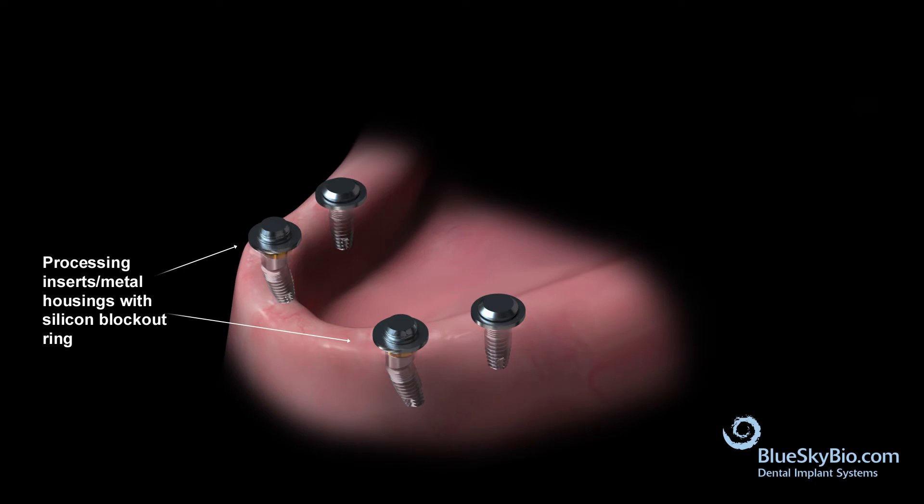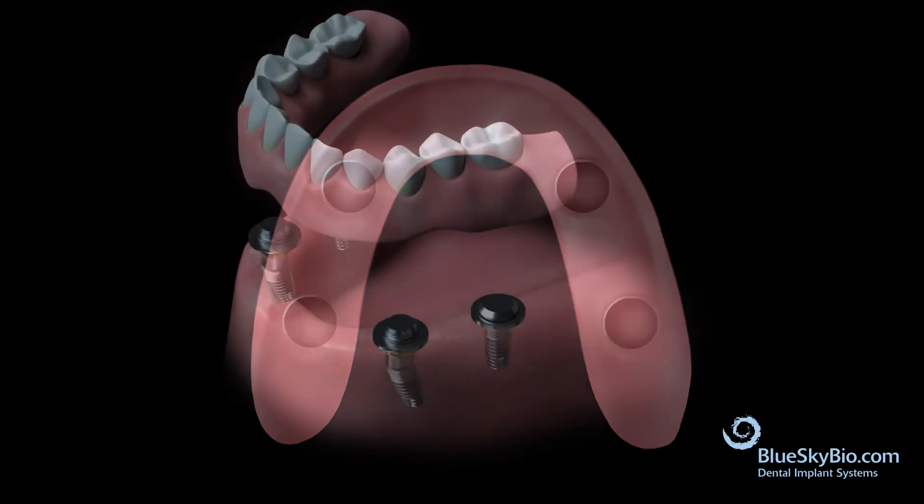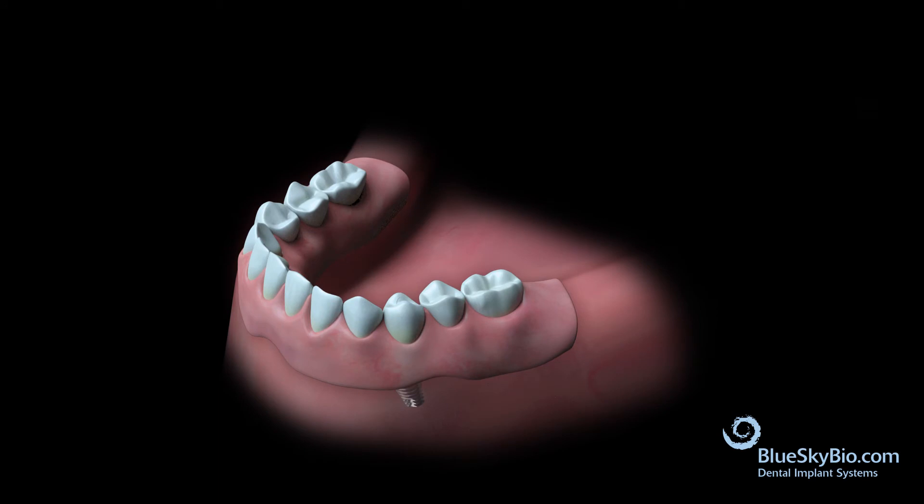Remove enough material from the tissue side of the denture to ensure that it doesn't interfere with the housings. Verify that the denture is seating passively over the retentive housings and adjust the denture as necessary for a passive fit.